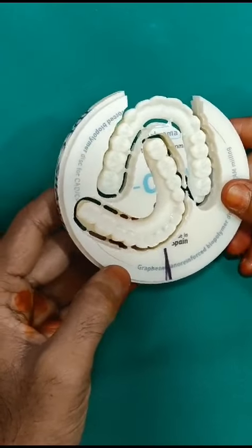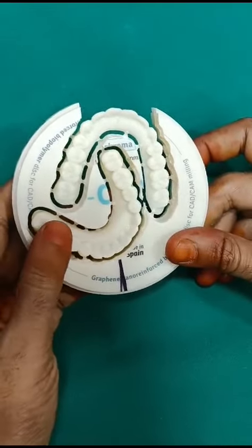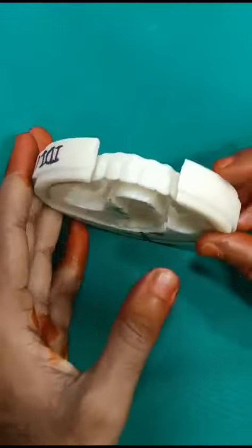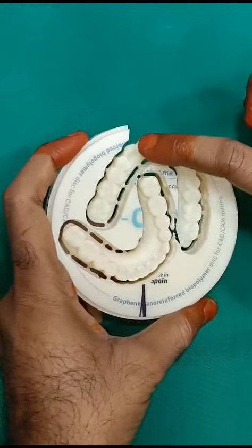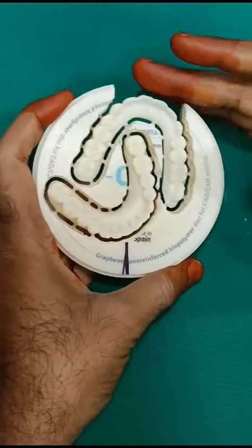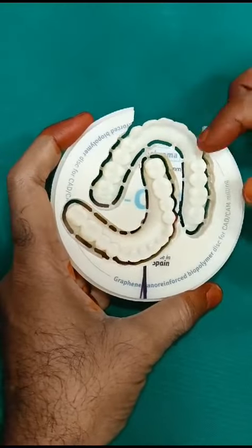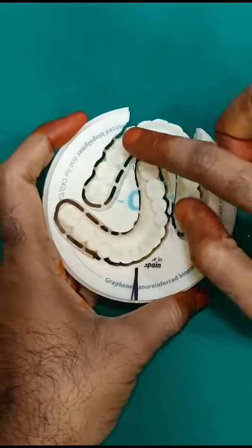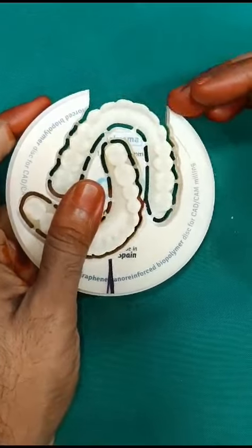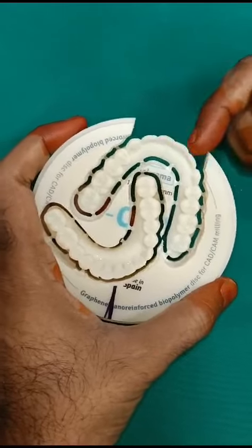For the lower second molar, sometimes it may create cheek bite, so we should be careful about that. The upper second molar would not create any trouble — only the lower second molar may. If the patient is asking for the second premolar we can provide it. The upper bridge is positioned in the blank close to the outer rim, whereas the lower bridge is not positioned as close. The upper canine to canine region of the upper bridge is aesthetically important.